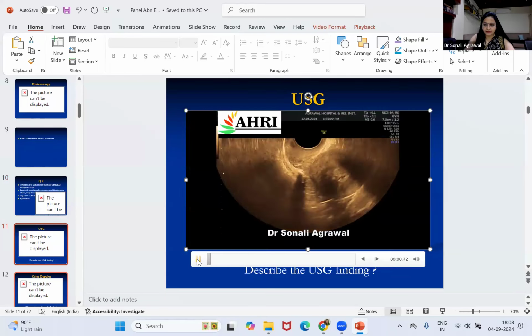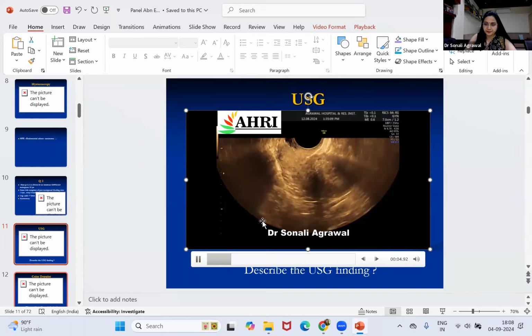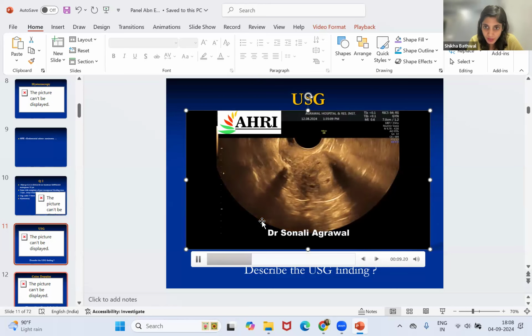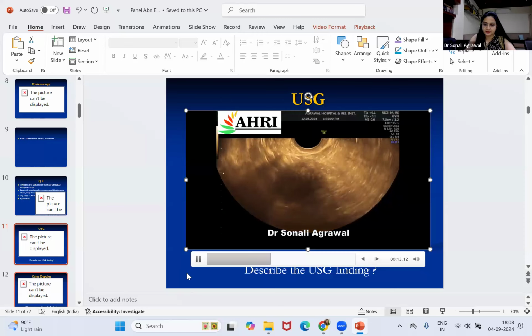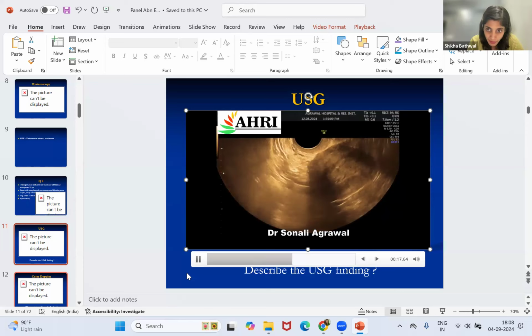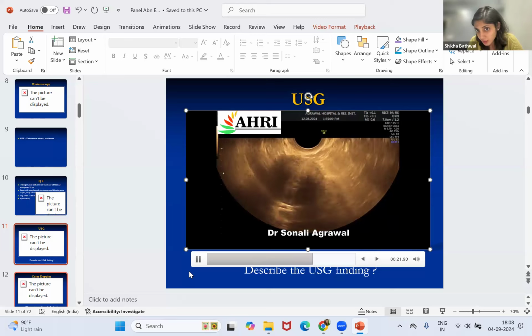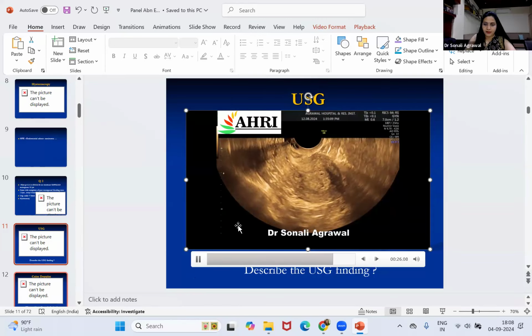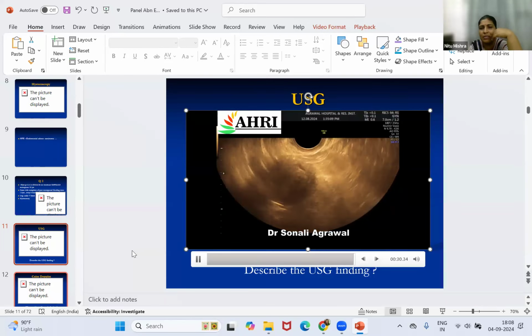Dr. Shikha: Yes, this ultrasound is showing a thickened endometrium with multiple cystic spaces, and it is inhomogeneous. Even though the endometrial-myometrial junction does not look interrupted, the cystic spaces are more pronounced in this case than in the previous one.